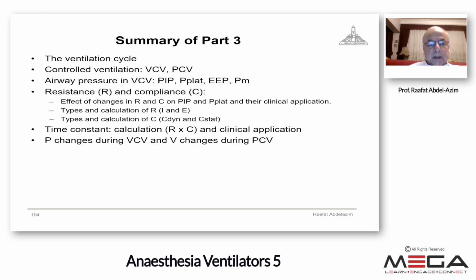I described the airway pressure changes in volume controlled ventilation and pressure controlled ventilation, and how resistance and compliance affect the peak inspiratory and the plateau pressure according to the reason of this increase, either resistance or compliance, and how we can differentiate between each part. I described what the time constant is and its importance in clinical practice by increasing or decreasing the inspiratory time according to the component of change, either in resistance or compliance. I described the pressure change during volume controlled and volume changes during pressure controlled ventilation.